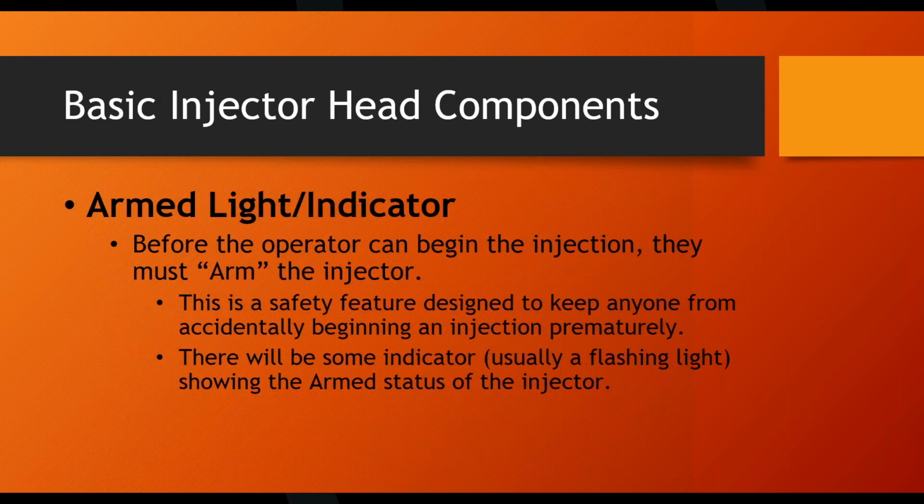Because now if that kills a patient because we fired an air bubble into them, they can prove, well, it wouldn't have done that if you hadn't said you'd checked for air. This comes up. I get a call from a lawyer's office, I was going to say once a year, but twice in the last year, wanting an independent third-party subject matter expert opinion on why this injector killed a patient. As a matter of fact, one time the patient didn't die. They fired an empty syringe into him, and I guess they noticed before it was lethal, but according to the lawyers, he's never been the same again. They wanted my opinion on what happened.